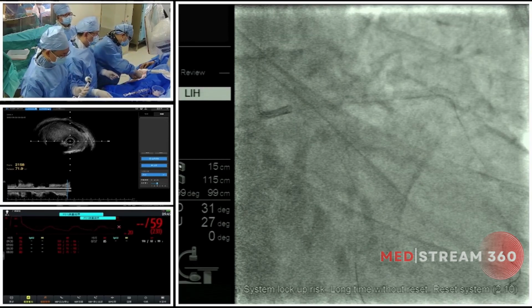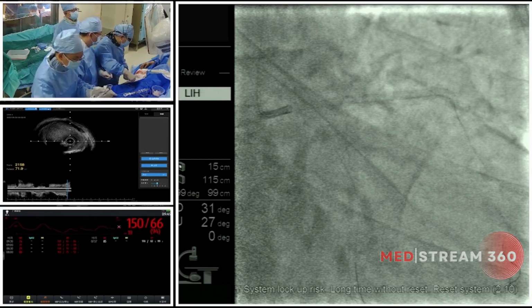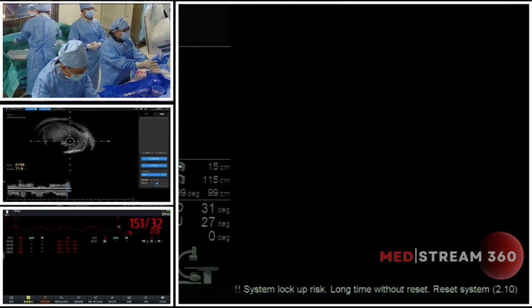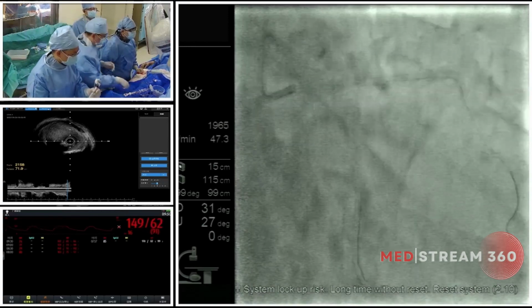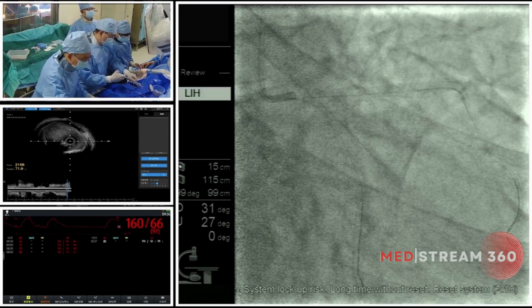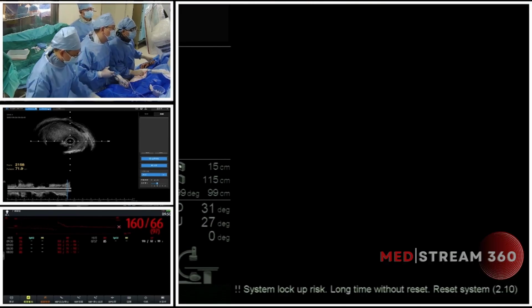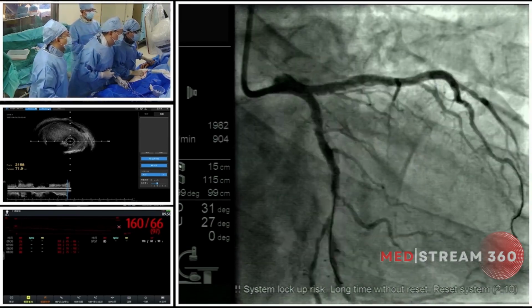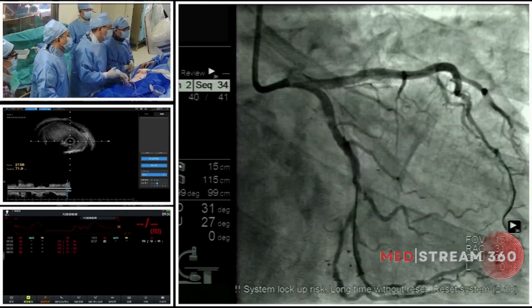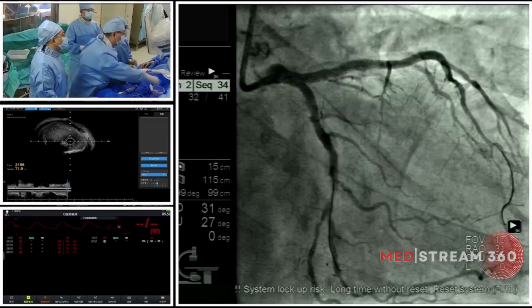But Dr. Cao and I have paid a lot of attention to the articles recently, and we cannot find articles about which one is better for the minimal stent area after stenting.